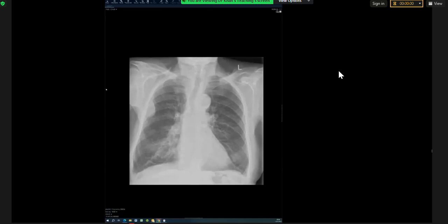Miliary can be ground glass. Yes, it can be. How to differentiate between collapse and consolidation? That's a good question. Usually they both happen at the same time. So that's one way to get out of a tricky spot. If you can't make up your mind, something has to have consolidated before it collapsed. So it's quite common to see in reports there is collapse consolidation.